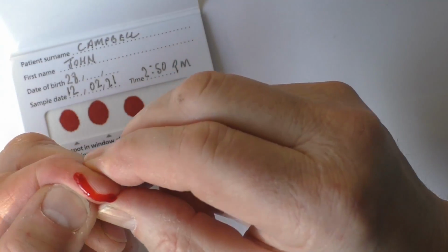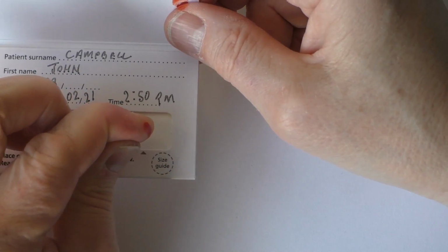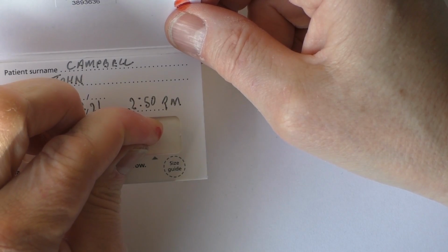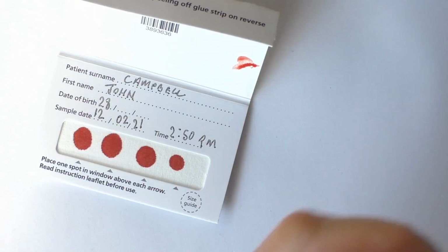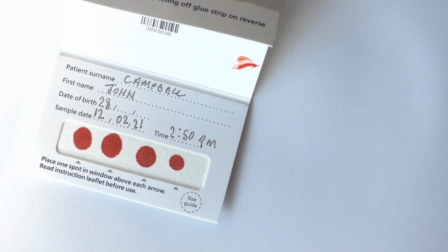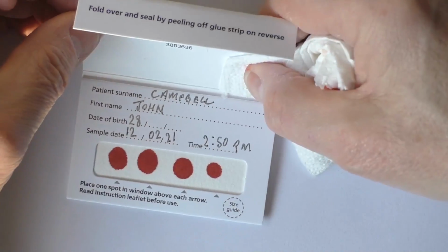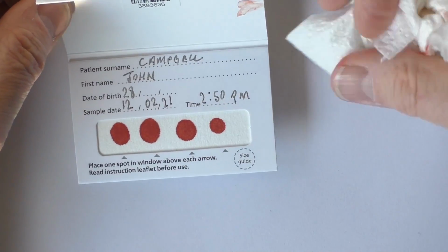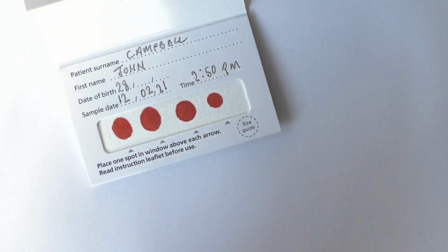And one more. Oh, the blood's going all over the place now. That's a bit of a pathetic one, but there you go. And then we can just wipe your finger. Apologies to the lab people for messing up their card. They will be wearing gloves, obviously, when they do that. Oh, it's still bleeding, look, so no other blood test required, though, so just put that on.